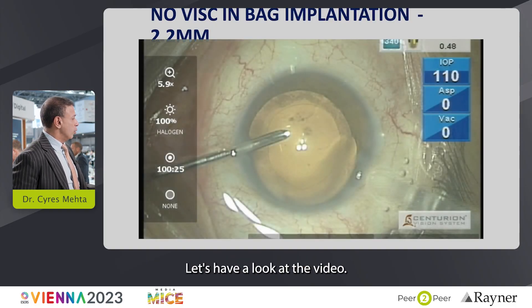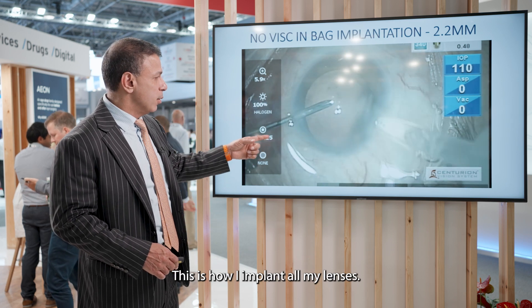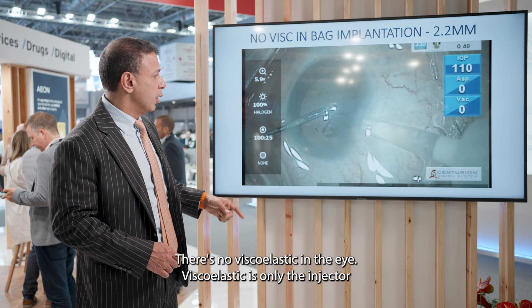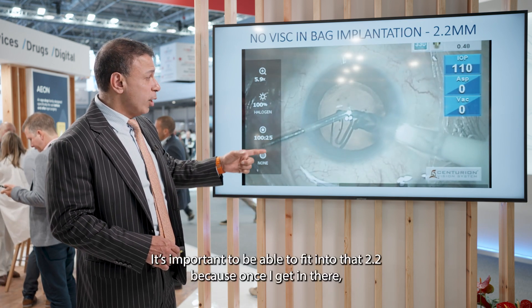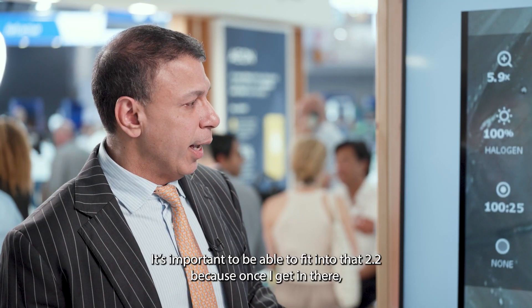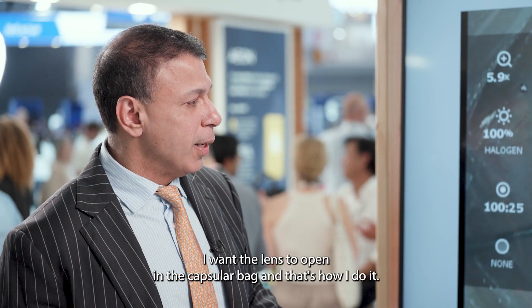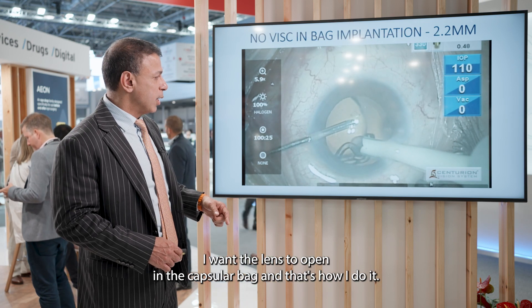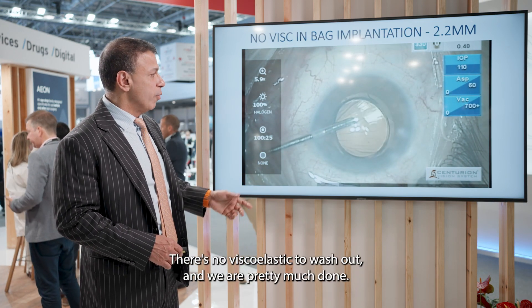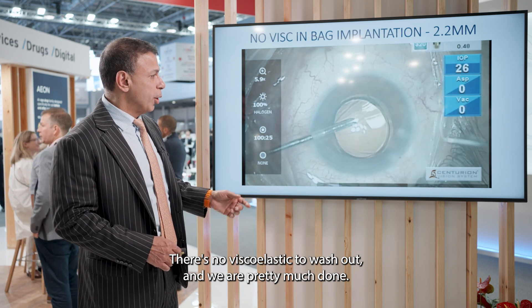Here's how I implant all my lenses. There's no viscoelastic in the eye — the viscoelastic is only in the injector. In goes the lens. It's important that it fits through a 2.2mm incision, so the lens opens in the capsular bag. The lens is open in the capsular bag — that's the end of the story. There's no viscoelastic to wash out, and we're pretty much done.